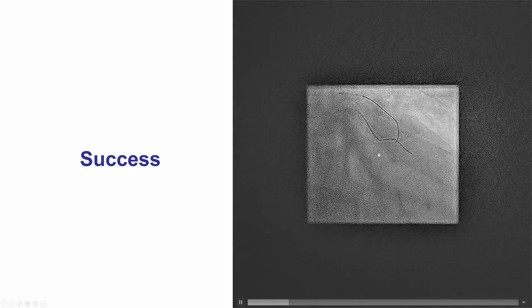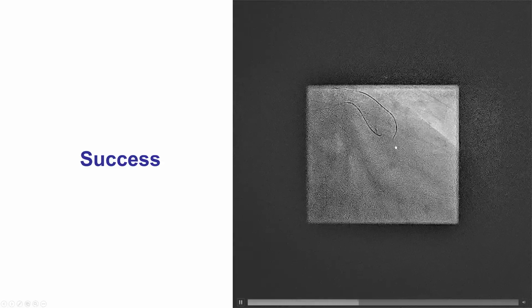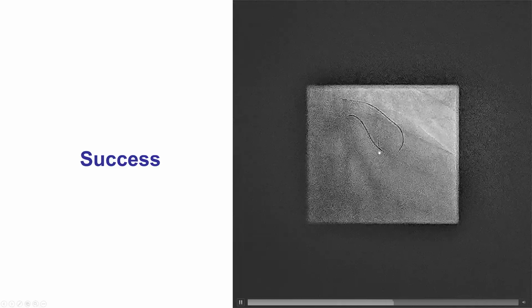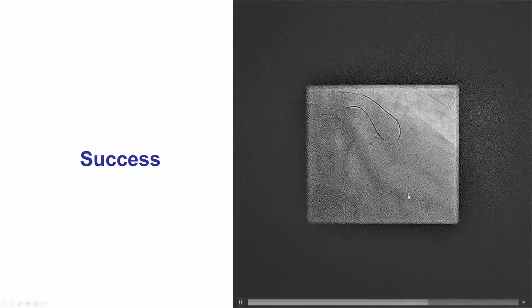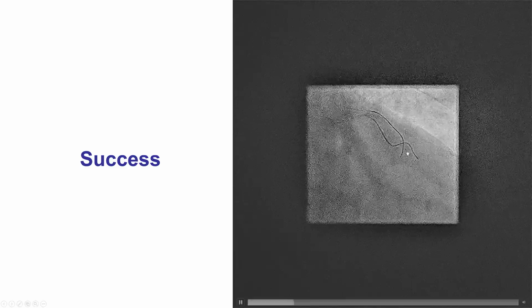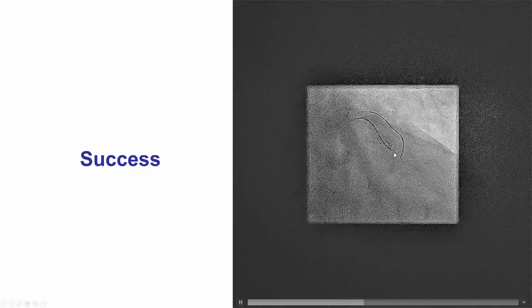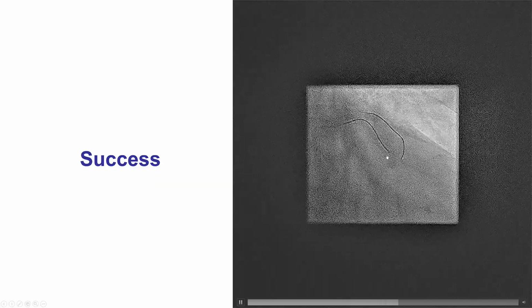Eventually, using a Suoh 03 guide wire, we were able to advance through that area of stenosis into the distal LAD. It did take quite some time, but it is important to stay with soft wires. The Suoh 03 is a very soft wire, atraumatic, unlikely to cause acute vessel closure, which is always a potential concern for these very tight, very eccentric lesions.